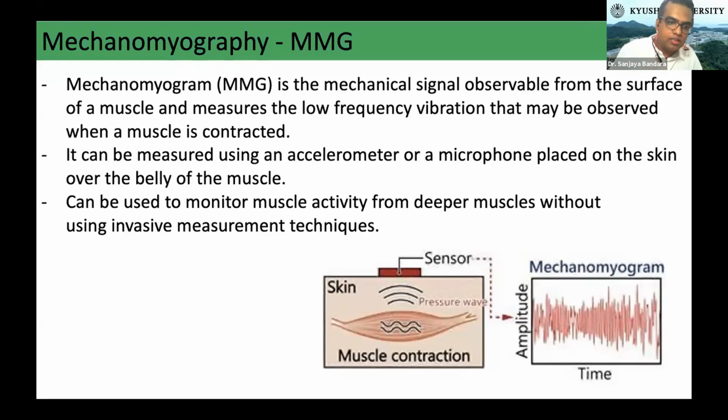One advantage is we can use this to measure muscle activity from the deeper layer of the muscles. But maybe we need some kind of differentiation techniques to identify. But we can measure the deep layer without invasive techniques.